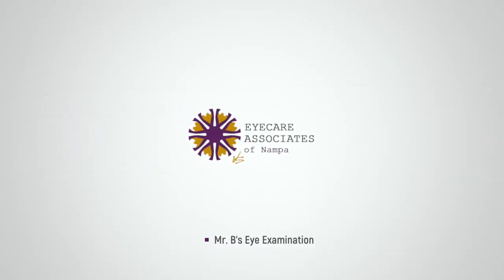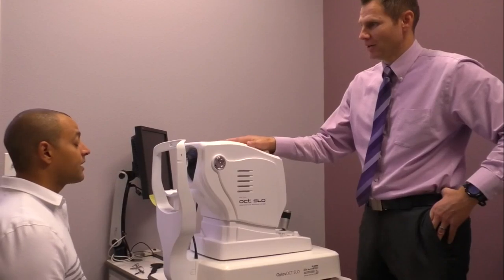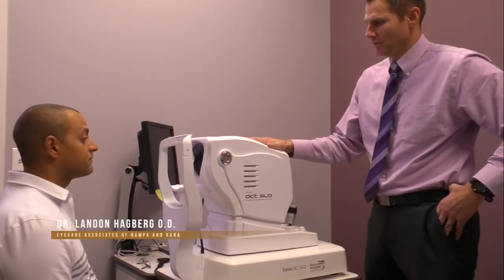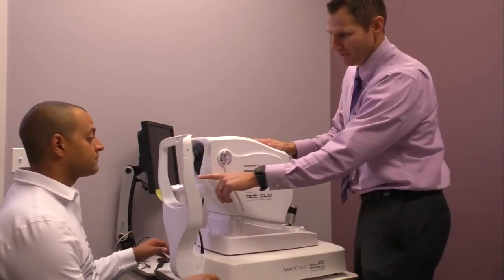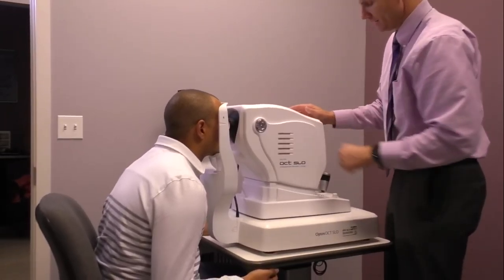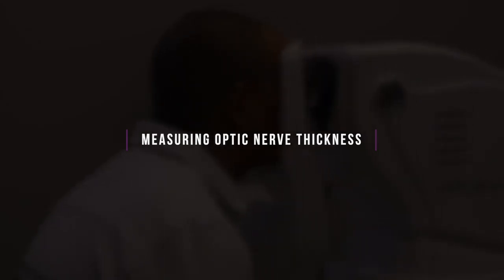Mr. V, we're going to get here just like we do every year to check on the thickness of your optic nerve and make sure nothing's changing. We're just going to repeat this test — go ahead and bring your chin in that chin rest and forehead right against there. We'll start with measuring your right eye first.